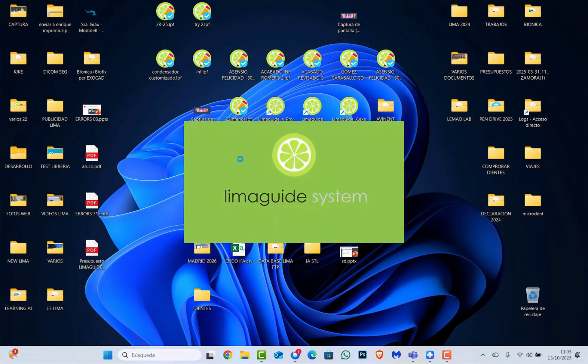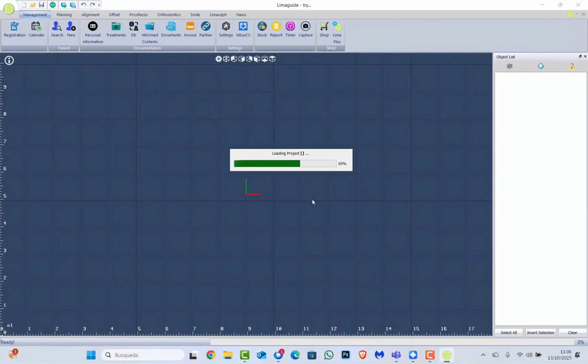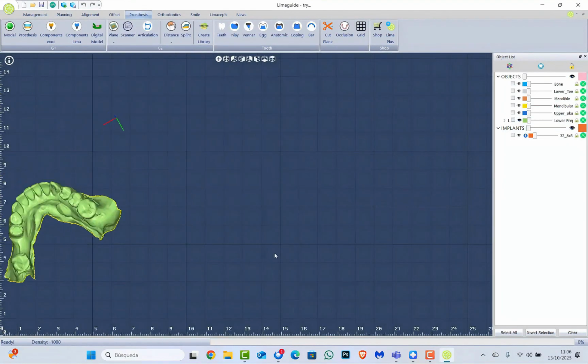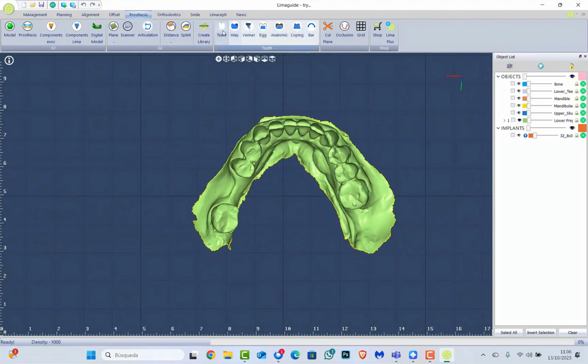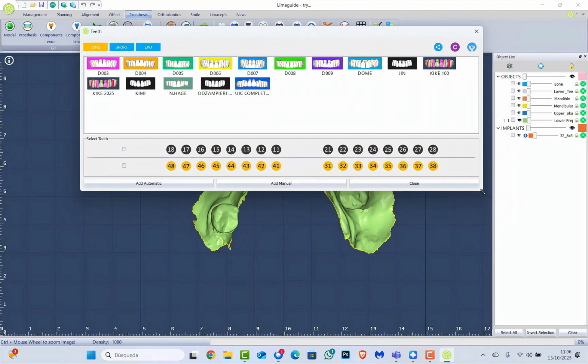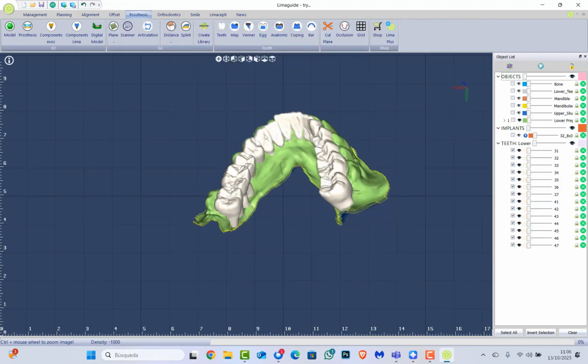So now I'm going to close everything and open Lima again. I'll choose, for example, this case. So I'm going to use this particular mesh here. And now if I go to the libraries, I will be able to see this new library that we already have created. I'm going to click on Kike 2025. I'm going to select the lower teeth. And as you can see, it places them on the mesh.